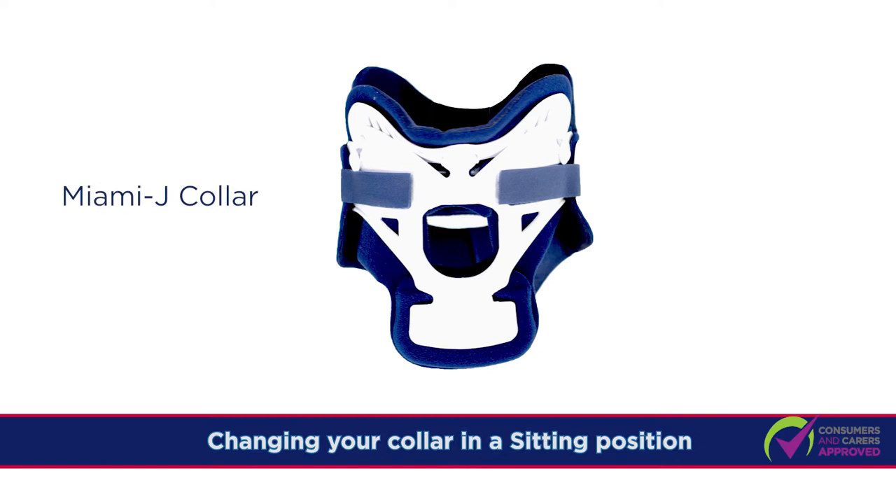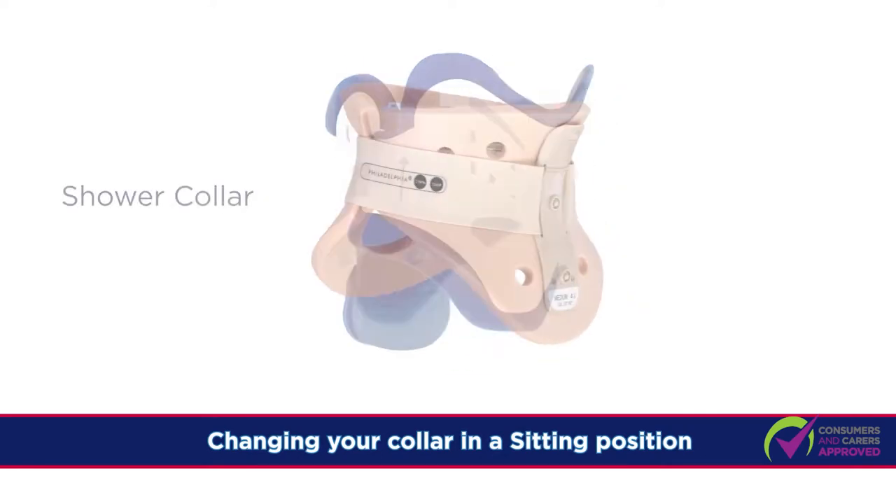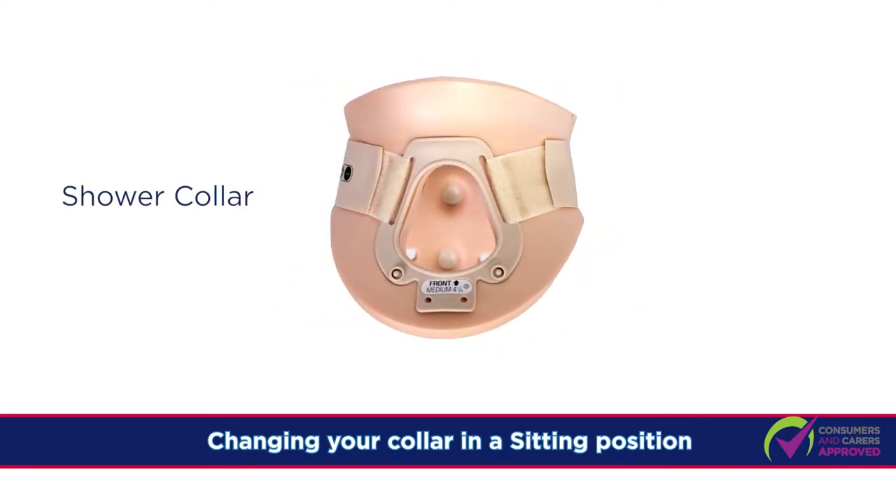In this demonstration, we will show you how to change from a Miami J collar into a shower collar in a sitting position.